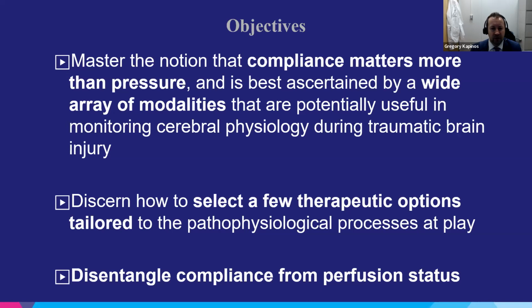We can discern also from those other modalities, especially the one that I'm going to talk about today, which is Transcranial Doppler, how to select better which therapeutic options we have, because in our armamentarium to treat an ICP crisis, we have many different options.